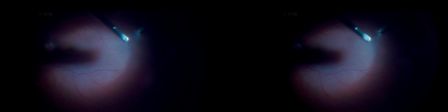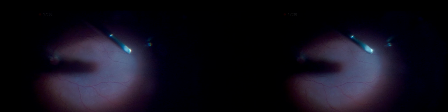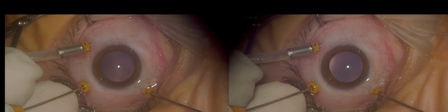By observing the retina periphery, the retina shows a whitish appearance, mostly where it is detached. A very small hole was seen, probably the one that caused the detachment. The retina was stretched somewhat and shortened. A chorioretinal scar, probably responsible for the local traction and PVR, was noticed.